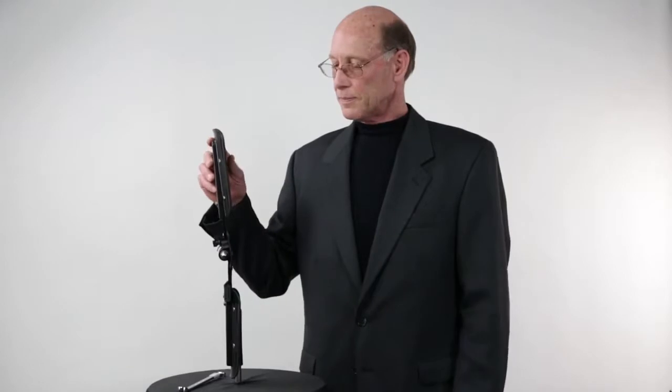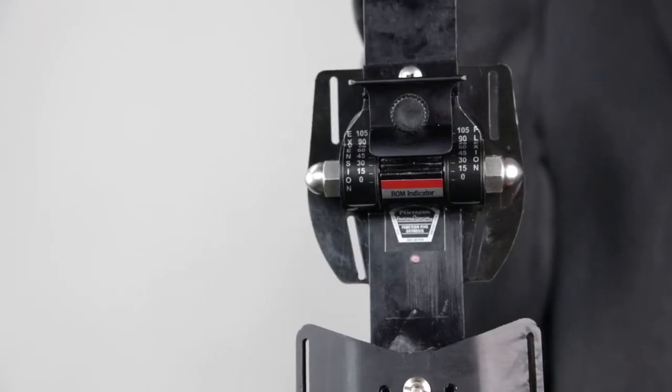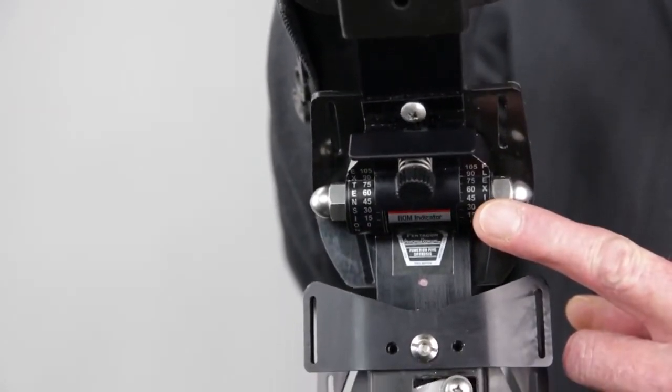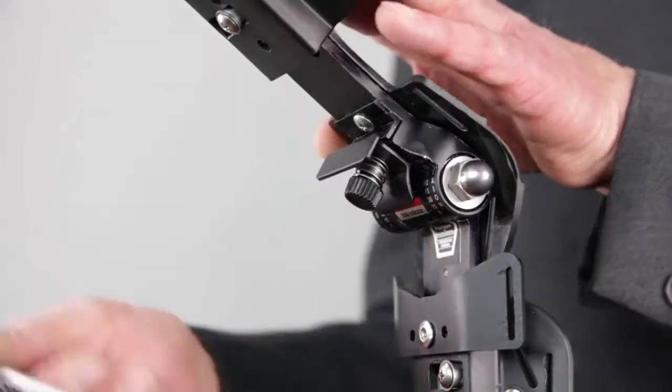Variable range of motion allows for independent limitation of both flexion and extension of the device. To set the flexion stop adjustment, start from the free motion position or with the extension stop already set. Flex the joint to the required degree corresponding to the red range of motion indicator.